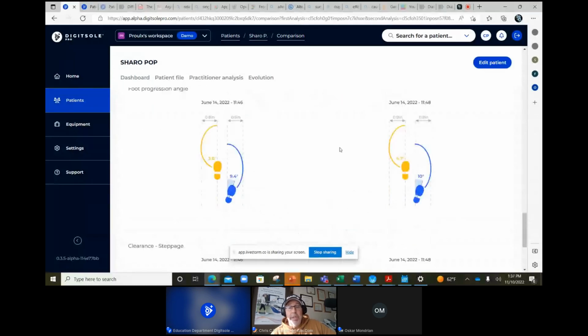Also, in the foot progression angle, we see that that remains also very similar. So again, when we have her walking at that normal speed, she still has that trajectory of that toeing out pattern that we saw over here in the slower position as well.